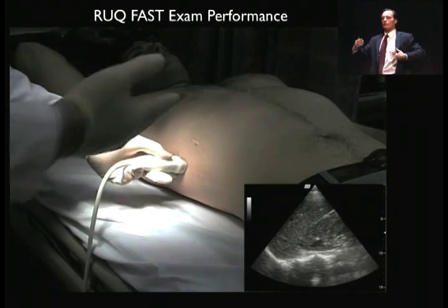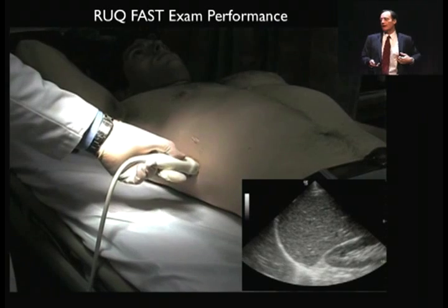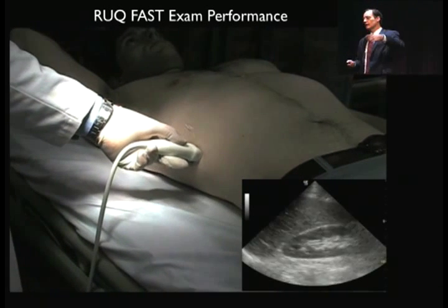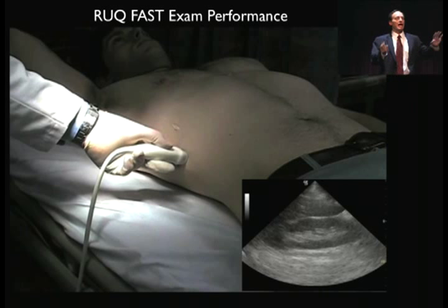So we want to start right there, and we can look up to see if the patient has a pleural effusion. We can look for fluid underneath the diaphragm. We're going to slide it down caudally to look through Morrison's pouch, okay? And then we're going to finish by coming even further caudal towards the patient's foot to pick up the caudal tip of the liver. Again, don't forget the caudal tip of the liver, or forget it at your peril.